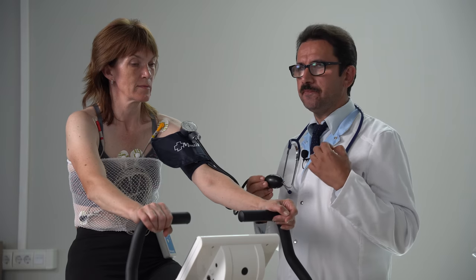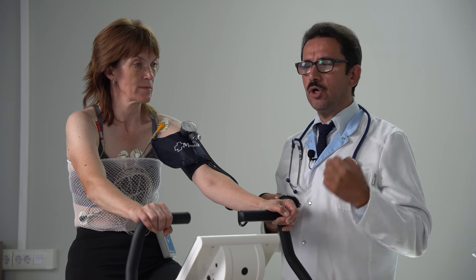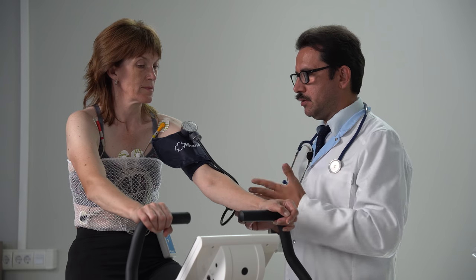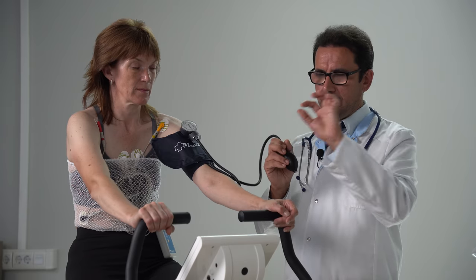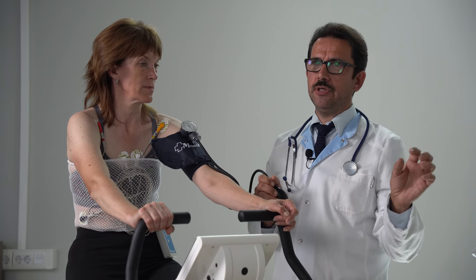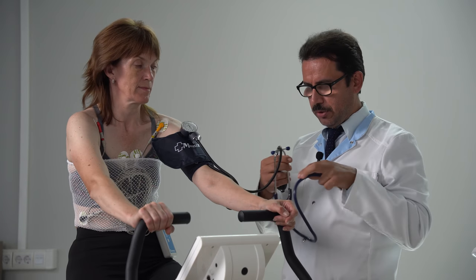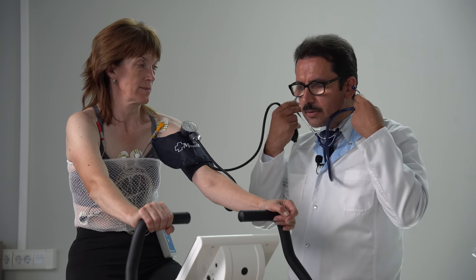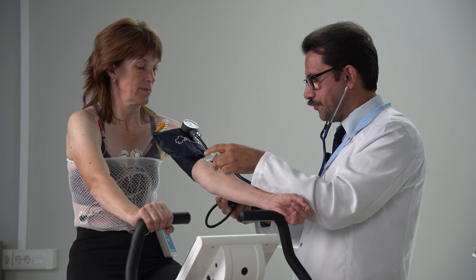Even ambulatory blood pressure monitors, they are not designed for this setting. So only a special system that is marked, okay, you can use it during exercise. So this system may be used because here a person measuring is doing the job.